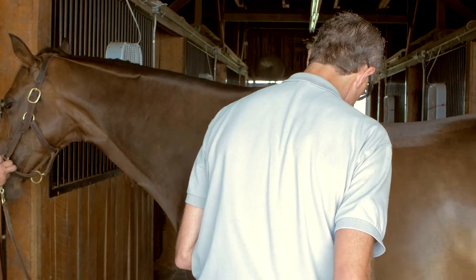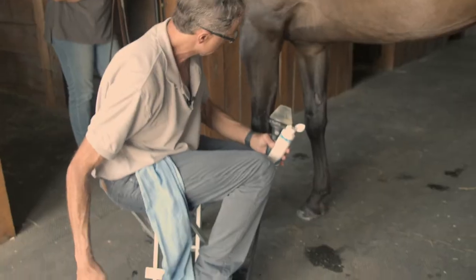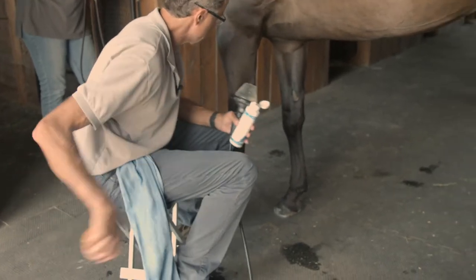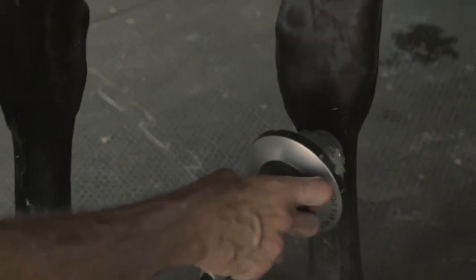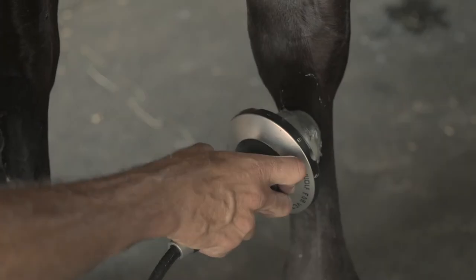Generally, what I'll do is catch the inside of the opposite leg while I'm still on this side, before turning the horse around. You start the same way at the insertion and drop down slowly, following the contour of the leg along the suspensory ligament.